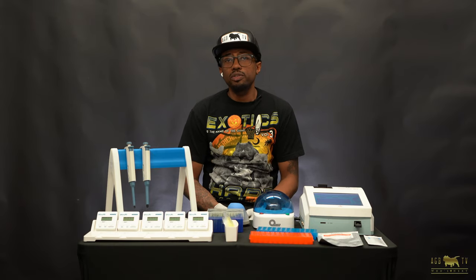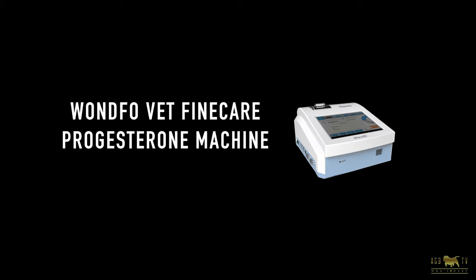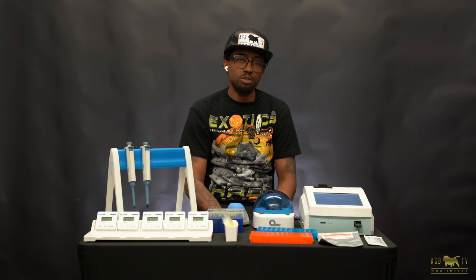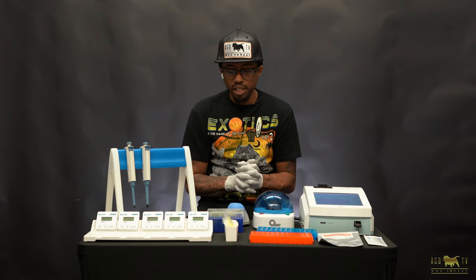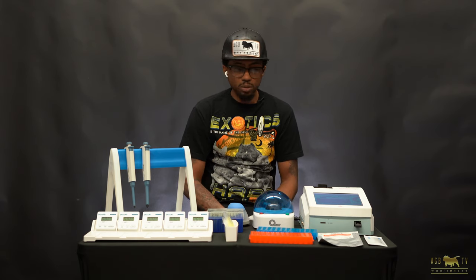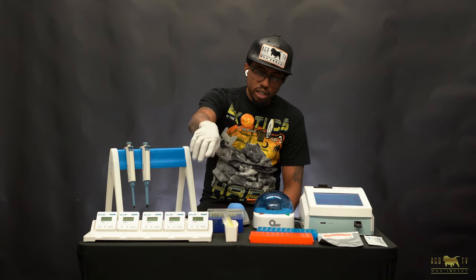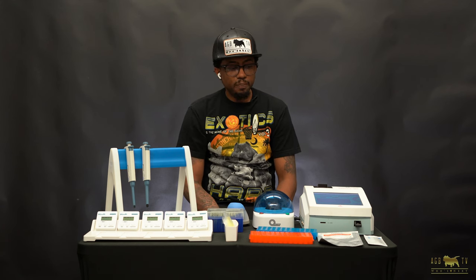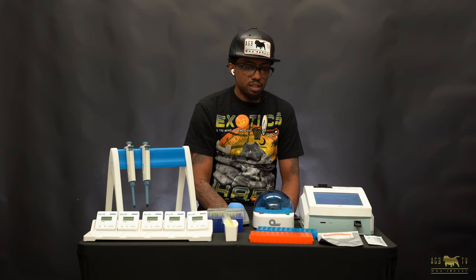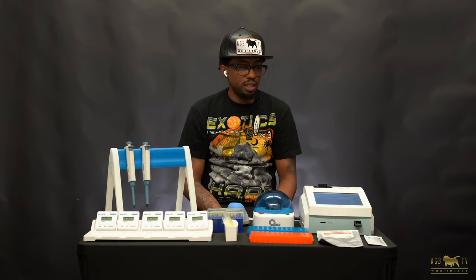Welcome back to another educational video brought to you by AGB TV. Today we're going to be talking about the Wondfo FineCare Progesterone Machine. Everything you see on the table today is everything that you can get in a bundle minus a few things. In the bundle you get the Wondfo, the centrifuge, and the five card slot holder that are required when you're running the test. Today we're going to talk about what it takes to run the test, the pieces that come with it, and what they're called.